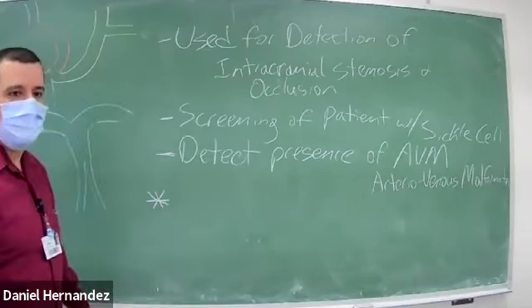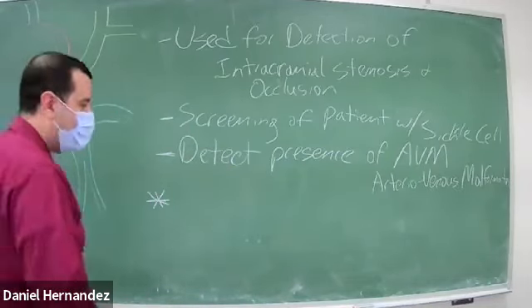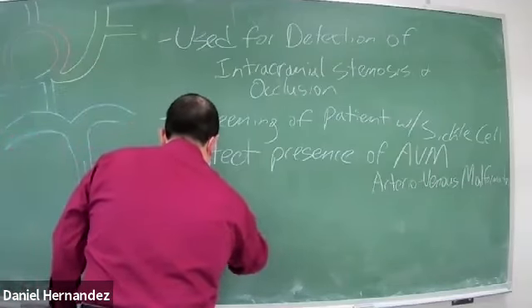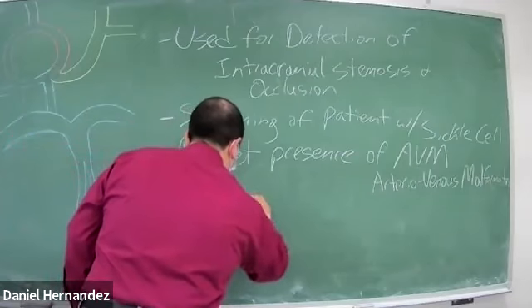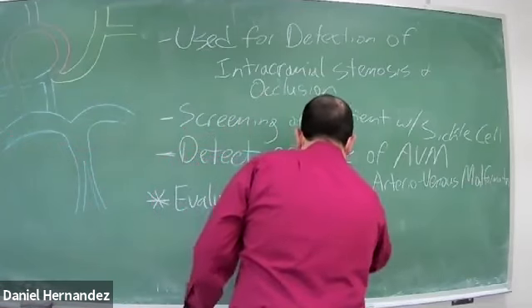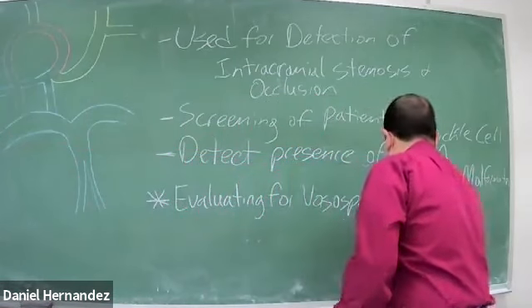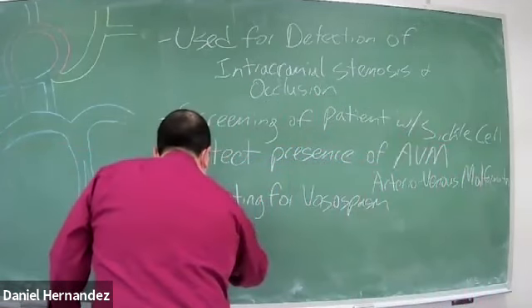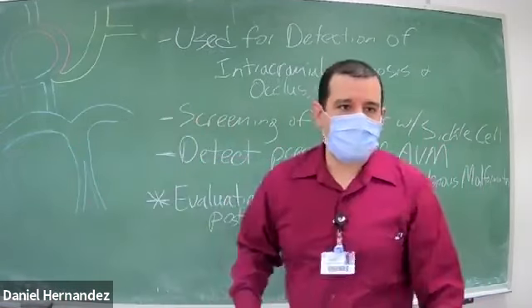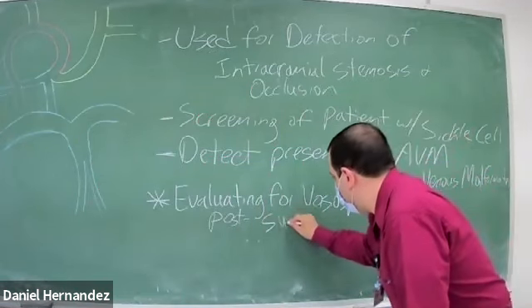One of the main reasons is going to be evaluating for something called vasospasm post subarachnoid hemorrhage.